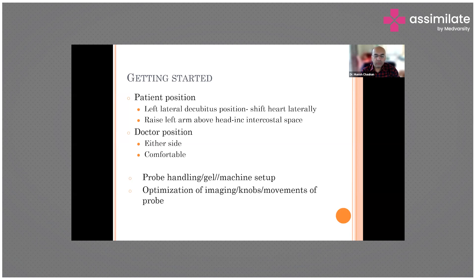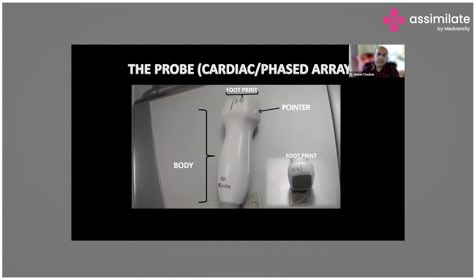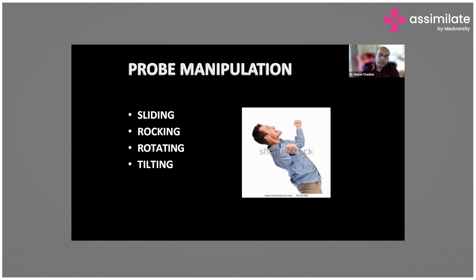Get used to probe handling if you are lucky enough to have a machine in your setup daily, so that you get accustomed to it. Familiarize yourself with the various knobs, imaging settings, and movements of the probe. This is the phased array cardiac probe that we use — it has a small footprint. This is the pointer we'll refer to later; this pointer matches with the pointer on the monitor. This is the body of the probe that we use.